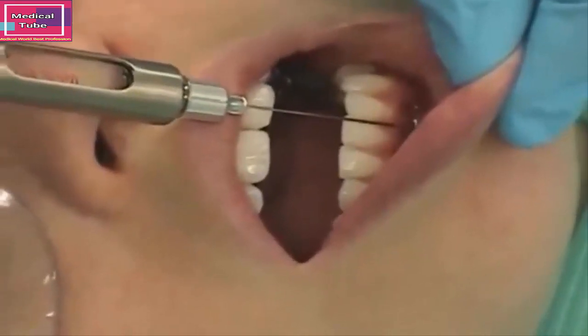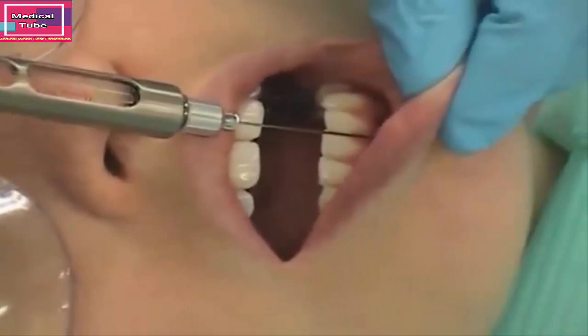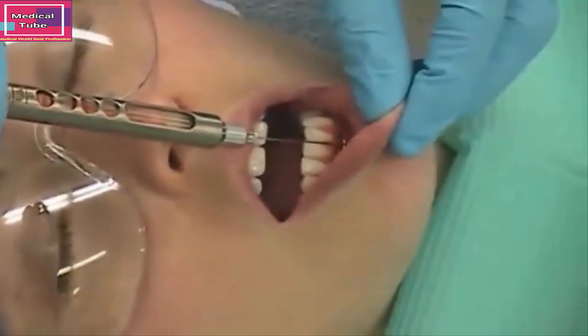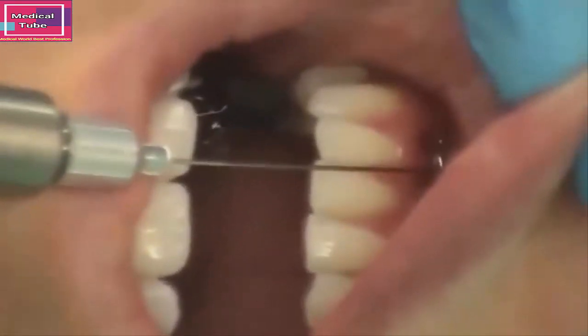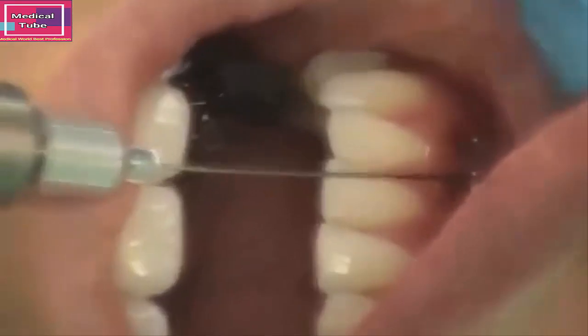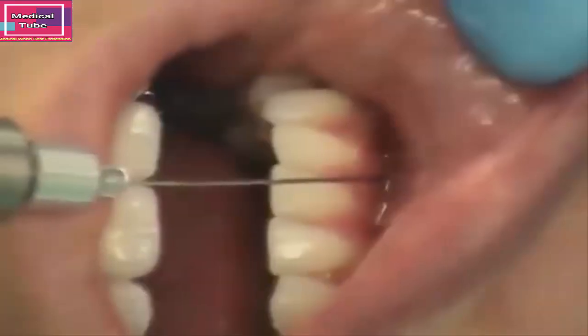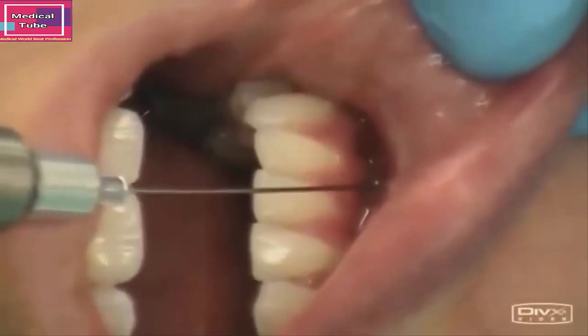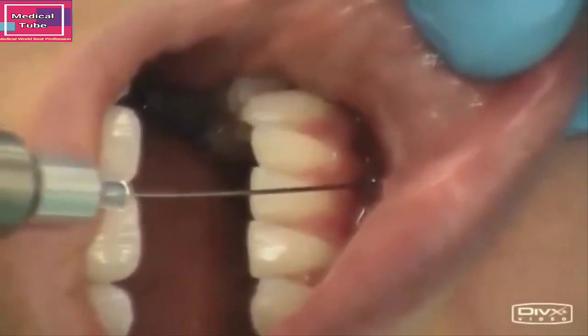The depth of the needle insertion for the maxillary will be at the apex of the tooth. For the mandibular, until the bevel is covered, about 2 to 3 millimeters. There is no osseous contact. Aspiration potential is less than 1%. Negative aspiration. The amount of solution is less than 0.6 milliliters over about 20 seconds.